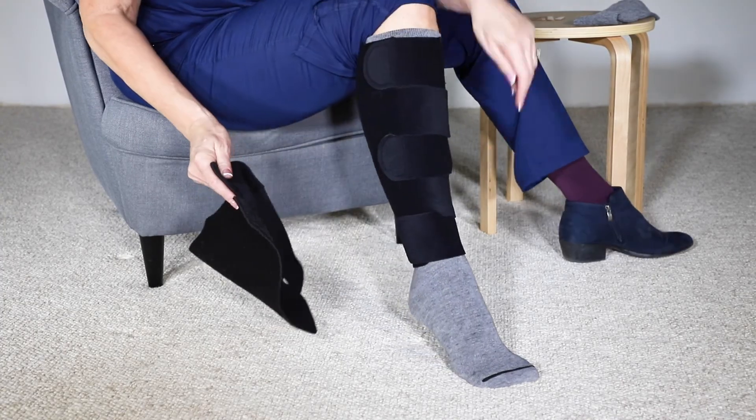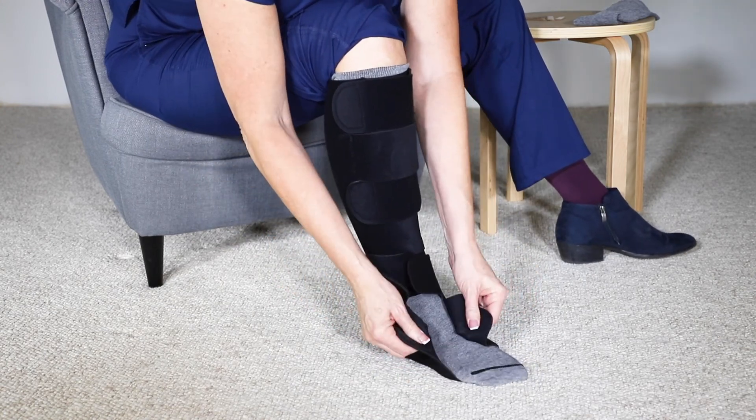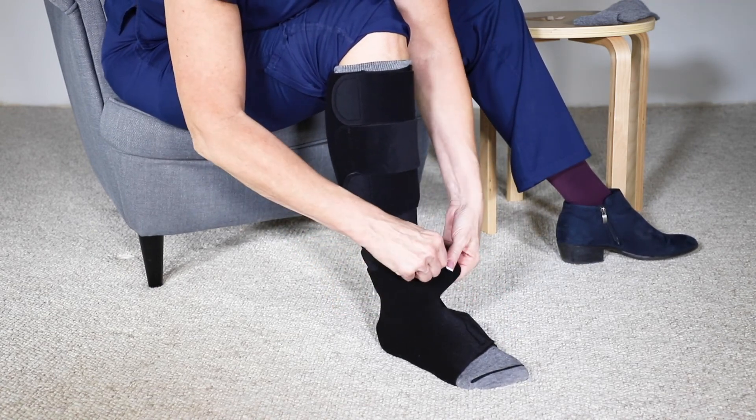To apply the copper boot, open the garment and locate the hole at the back of the boot. Place your heel in the hole and secure both straps snugly over the top of your foot.